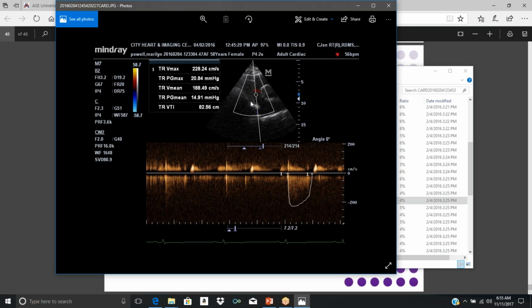So you're going to remember, you evaluate if the patient has tricuspid regurgitation. Anywhere you have the tricuspid valve, you need to do a Doppler study across that. Okay, so again, you have CW Doppler, and you have your ECG on the bottom. Everything is gated in echo. You have this flow. There's one there. There's one there. Okay, it's below the baseline, suggesting that there's a flow which is moving away. The transducer is right there. Flow is moving away from the transducer.